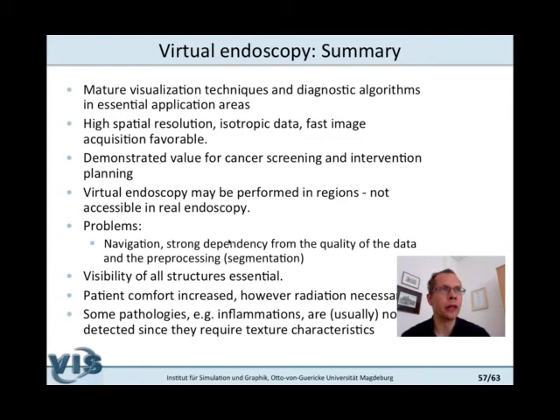So basically we interpolate some missing values in the Z distance to achieve an isotropic resolution. It would be even better if the data is isotropic from the beginning and no resampling would be necessary, because resampling always introduces a certain amount of error.